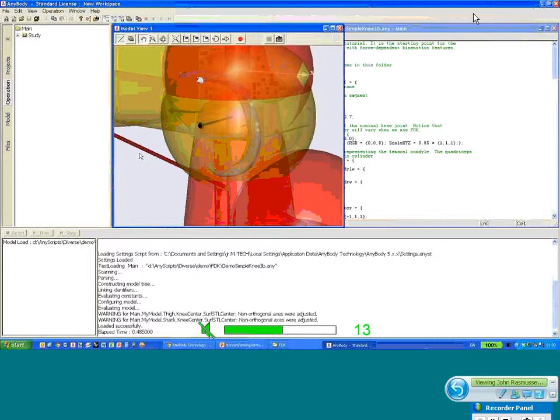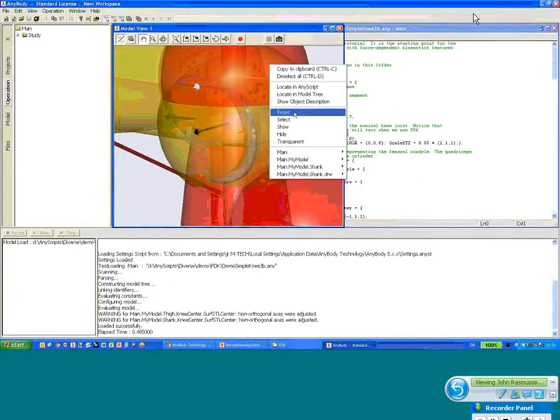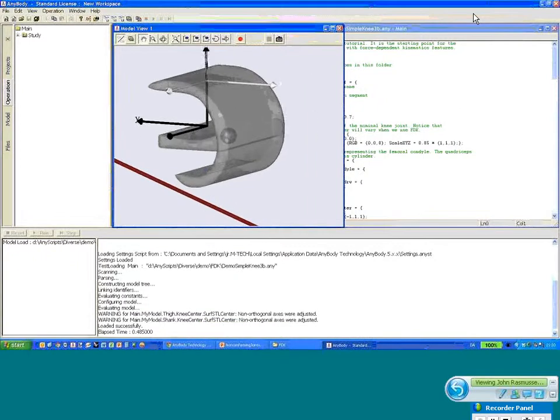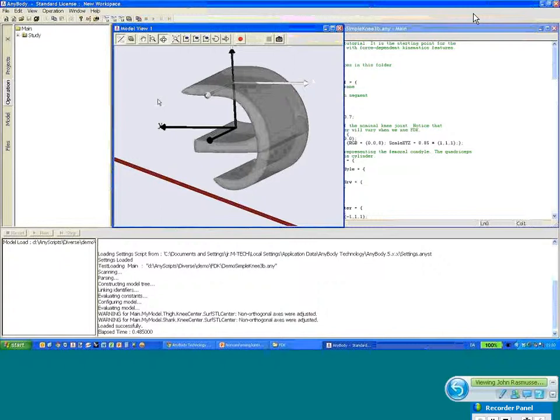What you can see is that inside the model we now have a gray part here. And I'm going to switch off some more stuff so that we can more easily see what that is. So we hide this, and then you can see that these are a couple of metal components that we have placed inside the knee. And these metal components are not completely aligned now, they will be aligned in just a second. But there's a femoral component here, and there's a tibial component here. And in just a moment, when we run the analysis, these two components are going to be in contact with each other.